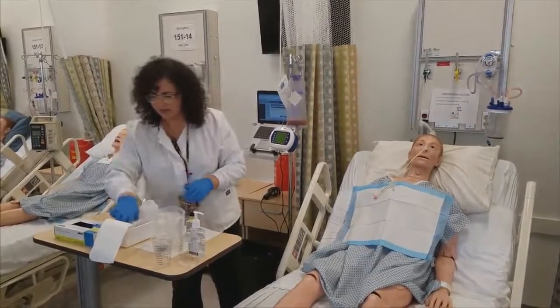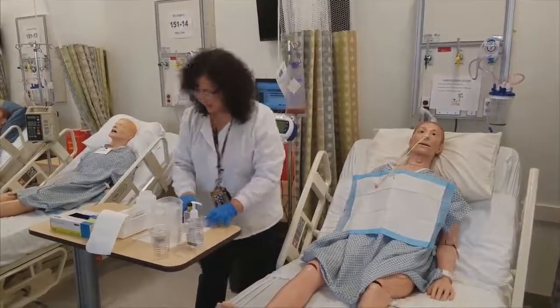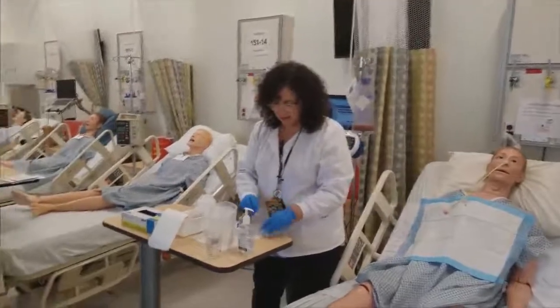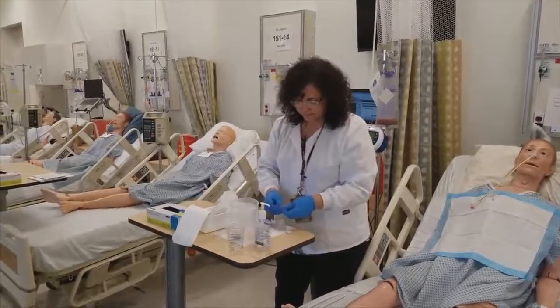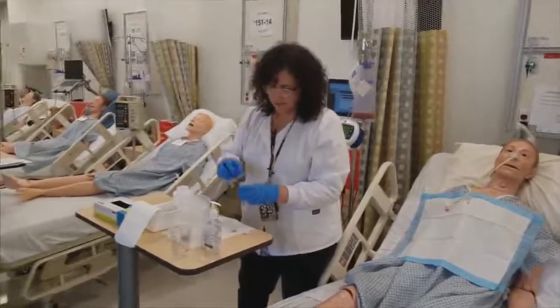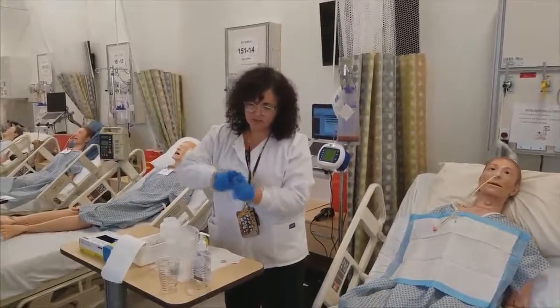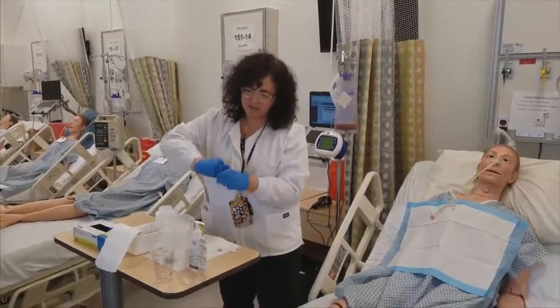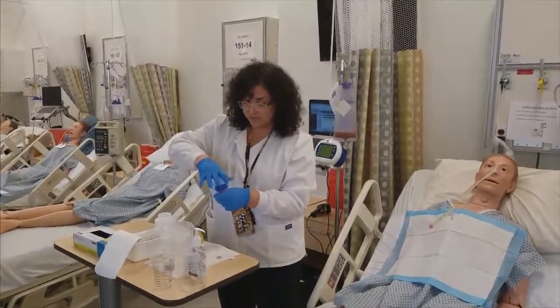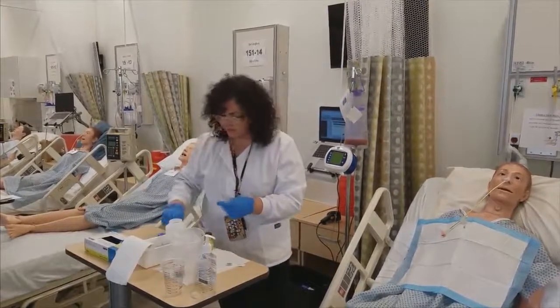Okay, I have the patient's designated pill crusher here. It's nice and clean. I could clean it with an alcohol pad if I need to. And then I'm going to go ahead and just drop this in, and then turn it into a fine powder. This particular feeding tube clogs very easily, so we have to be careful that we mix it well.